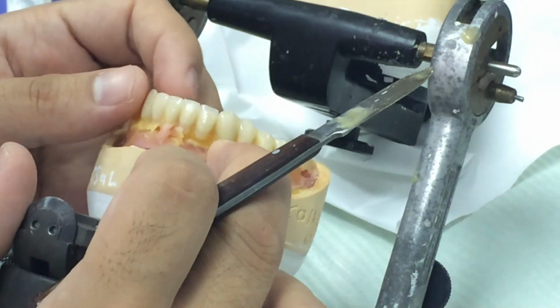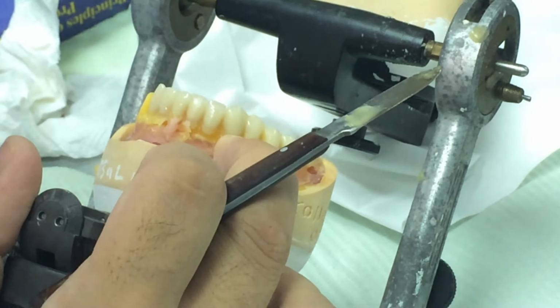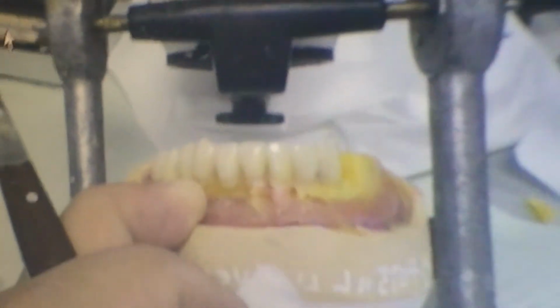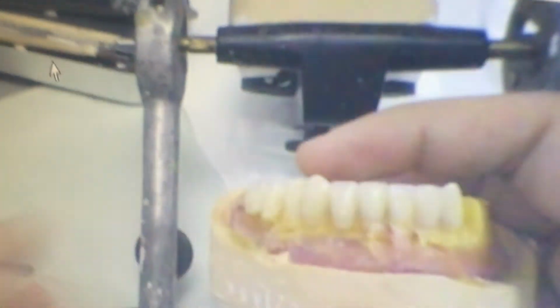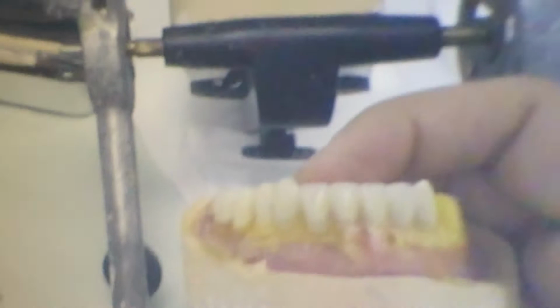So the wax rim has the relation from the guidelines. The wax rim gives you the correct position for the teeth. That means this is the sequence: guidelines, wax rim, teeth set-up. Is it clear?